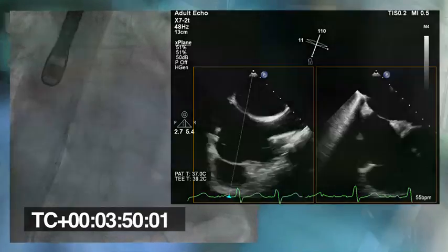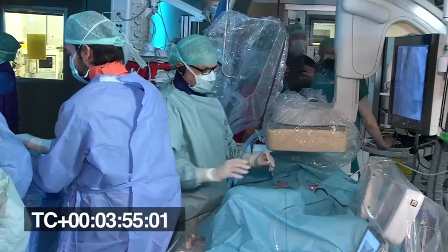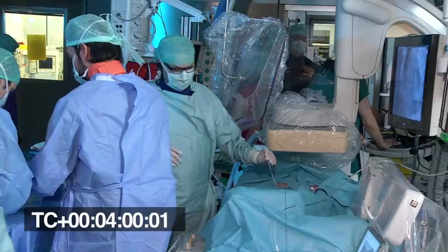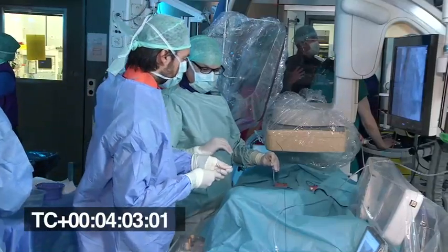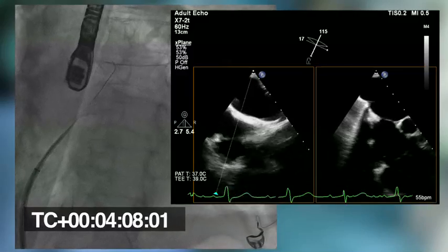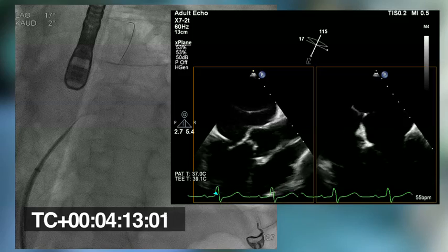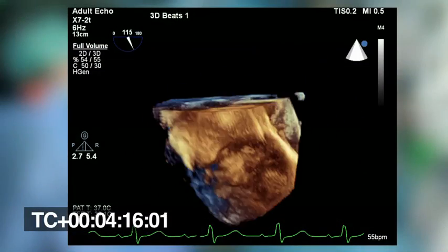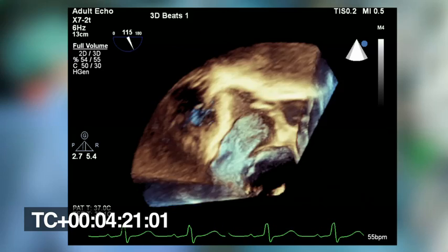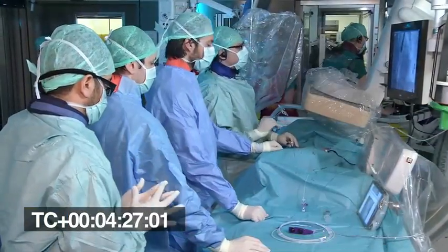It was too posterior. The septum is a bit bulging, so there is no way to really get back in position until you restart the procedure from scratch. Second attempt. We are through the septum for sure. Now I put the wire, which shows exactly where we are. The wire is a bit higher there — I think it should be acceptable. The transseptal position is okay and we can advance the wire.